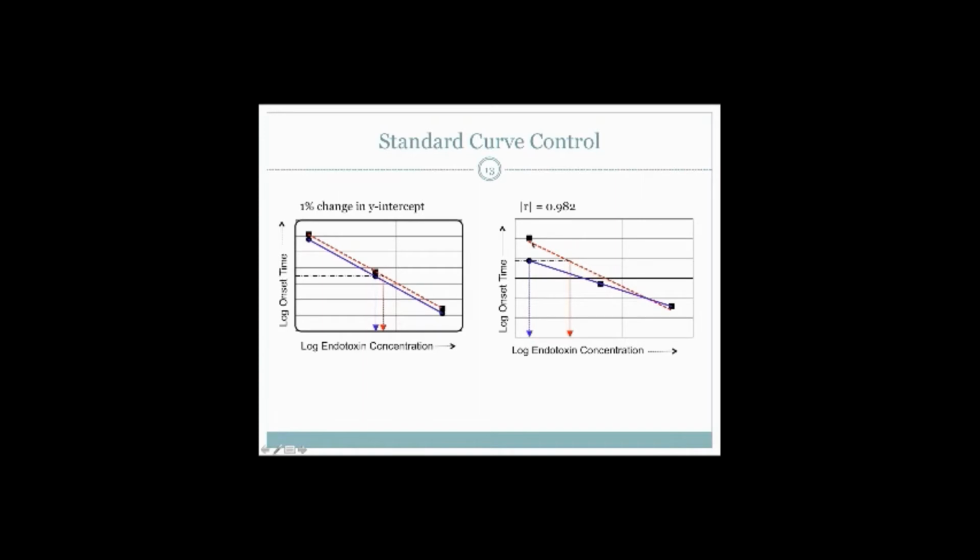But again, you can see that this nonlinear standard curve changes the slope, and it also changes the y-intercept. Here's the y-intercept. Now again, I have different calculated values, and again, it's for no reason other than an artifact of the standard curve.